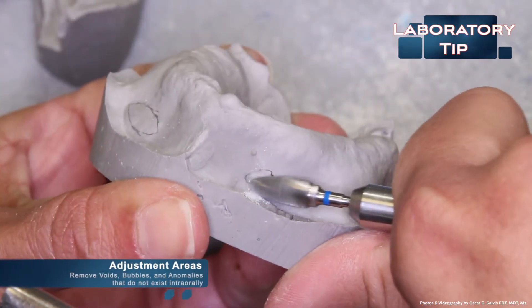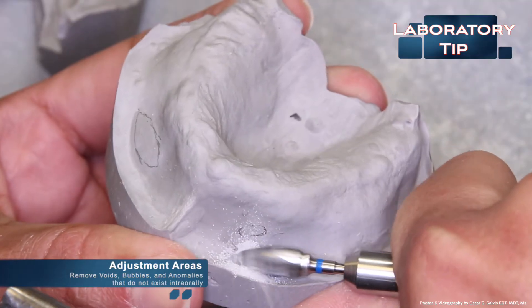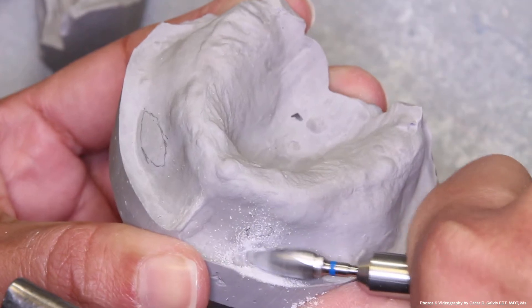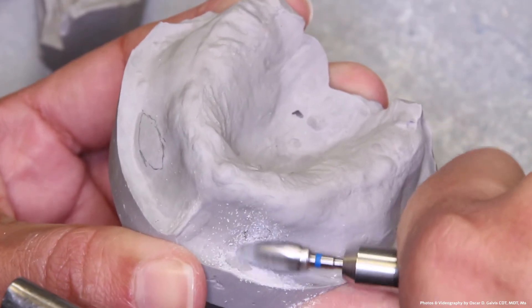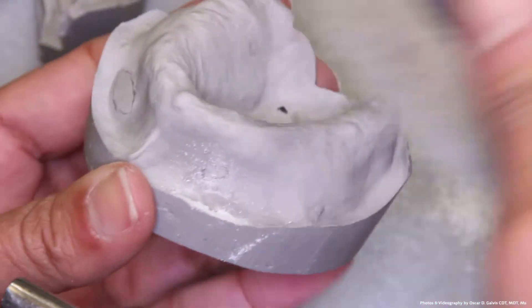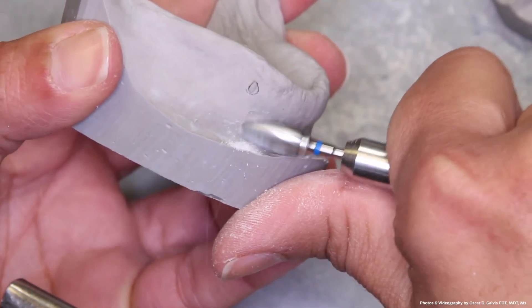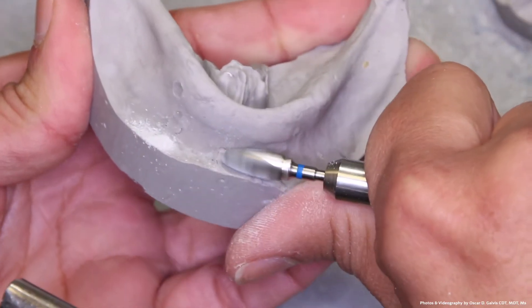Once these areas have been designated with a pencil, you can adjust them with a carbide bur. If we are adjusting the depth of sulcus areas, we can use the contralateral side as a guide for how deep the border should be. Humans are bilaterally symmetrical. Usually, the depths of the sulcus on one side should equal the depths on the other. This is not true for everyone, but it happens to be the usual average.